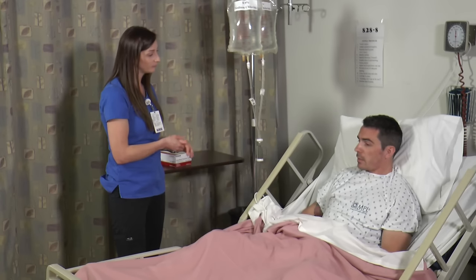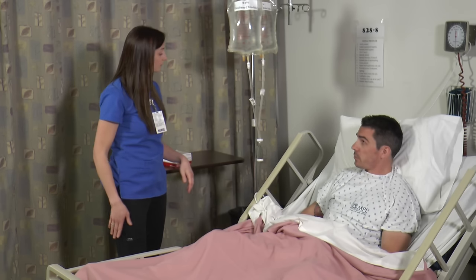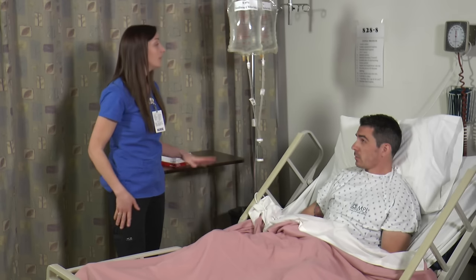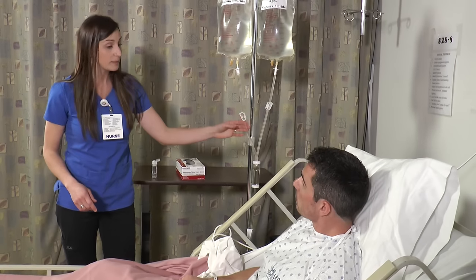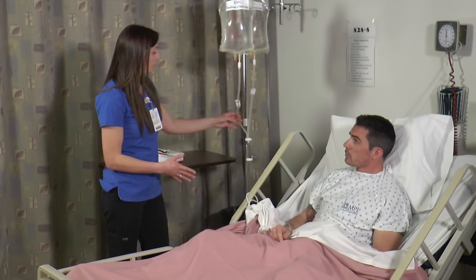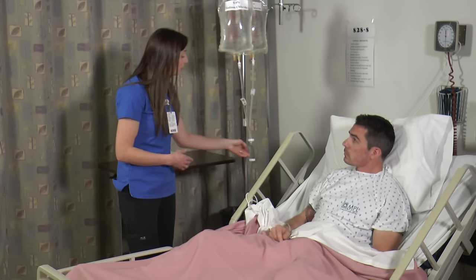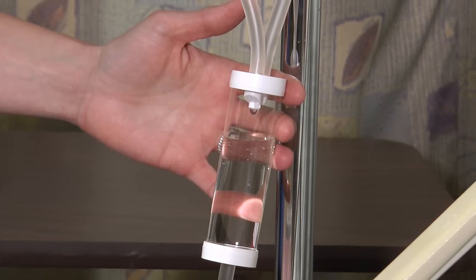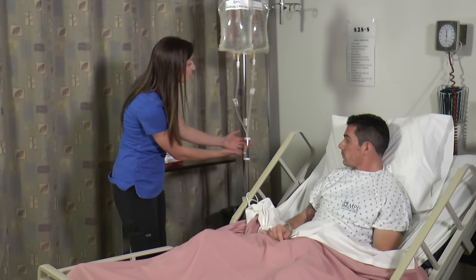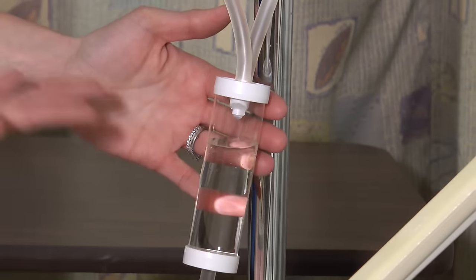Okay? That makes sense. Now, I also noticed after the procedure, this solution was running very fast, but now it seems to have slowed down quite a bit. Is that normal? Yes, that's a great question, and that is totally normal. This is always going to be constantly dripping. After surgery, what happened is that you were bleeding more, so the drip rate was faster. We base the drip rate upon the color of the drainage that is coming into the gravity bag. So when you came out of surgery, you had a much faster drip, but that's because you had much darker drainage. Now that your drainage is much lighter, we were able to slow down the infusion per the physician orders.